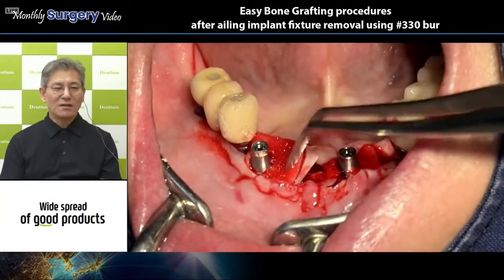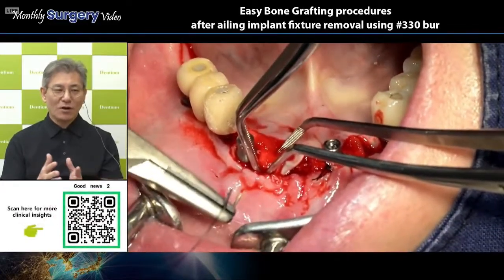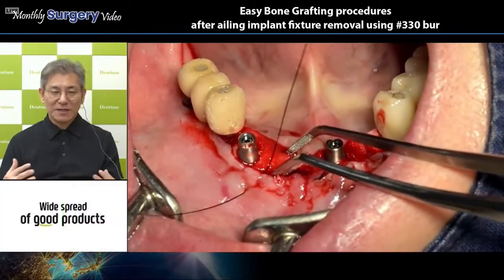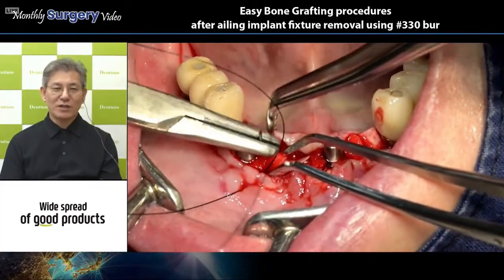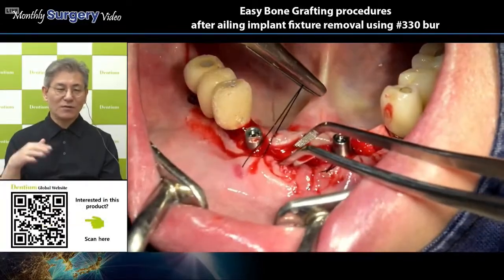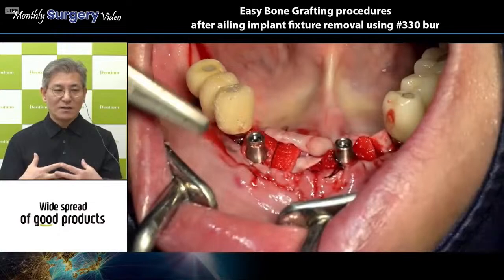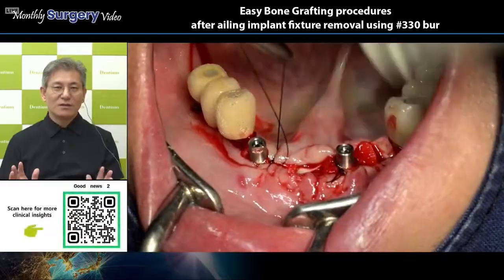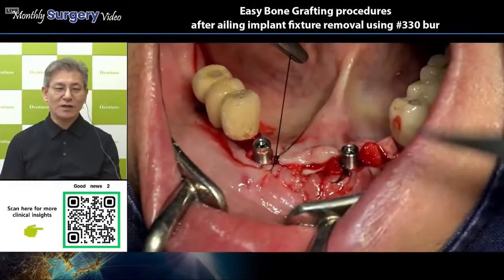So it means even if the wound flap is open, never mind, because this collagen graft protects this opened area to promote faster soft tissue healing. That is why they use this collagen graft on top of the barrier membrane. This collagen membrane works as the barrier membrane to protect the underneath graft materials until new bone formation, right?